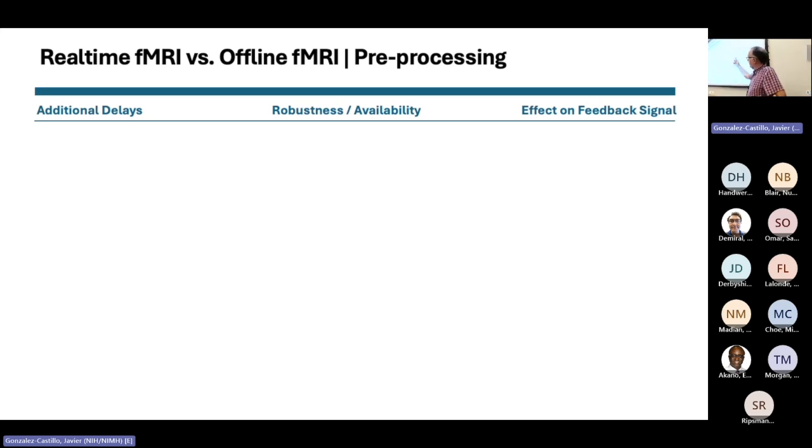And finally, because we care about these two things a lot, it might be cool to do, I don't know, a slice timing correction, but does it really matter from the point of view of the neurofeedback? If not, we might not. Well, when we're offline, let's just do everything the best we can because there is no loss.